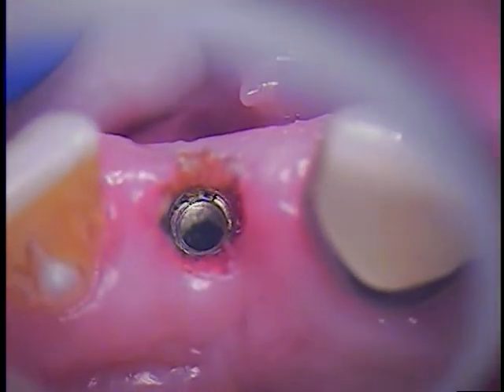Endo Explorer. It looks white in color. Being very, very careful not to abrade anything. Let's see if it'll come out by spinning it out. Microsuction, yellow tip, and leave it, don't bend it, just leave it. Let's see if this spins out. It's at the base for a reason, I don't know why. I do want to identify it. I don't know what it is.